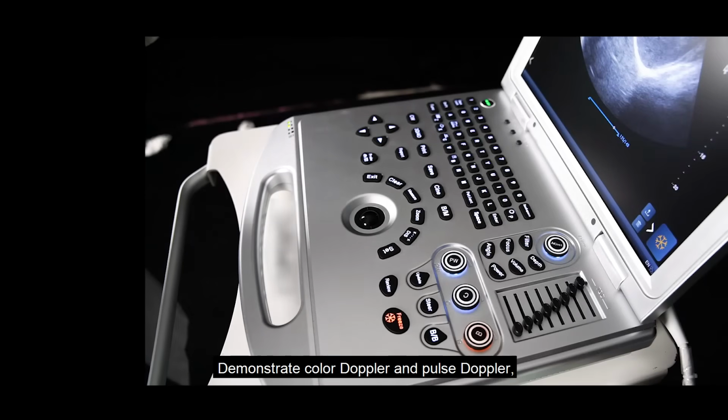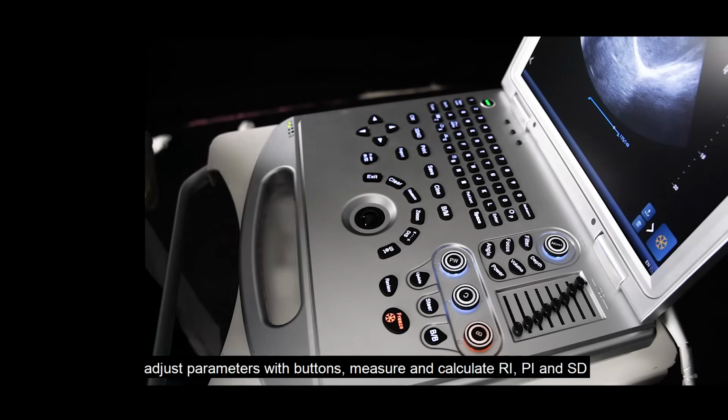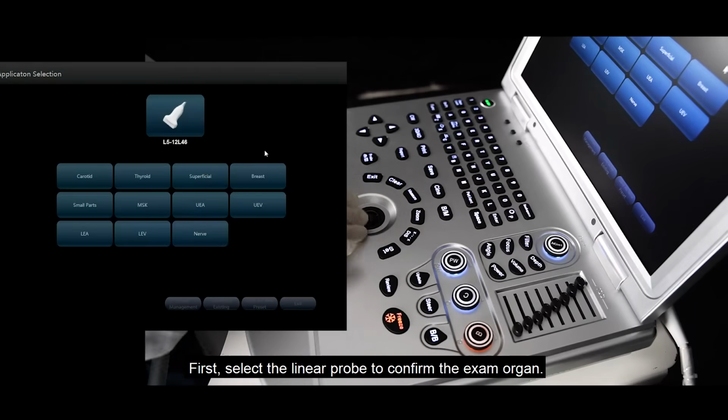Number 2, demonstrate color Doppler and pulse Doppler. Adjust the parameters with buttons, measure and calculate RI, PI, and SD. Take carotid exam as an example. First, select the linear probe to confirm the exam organ.